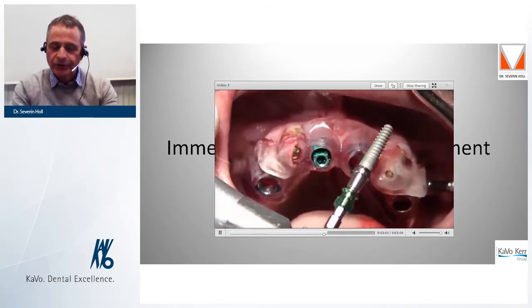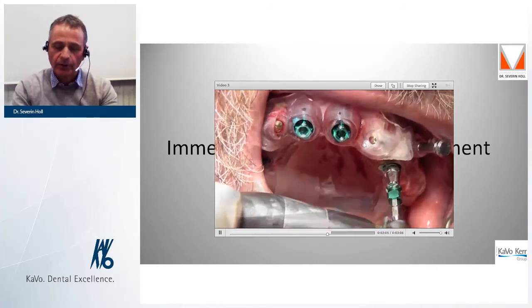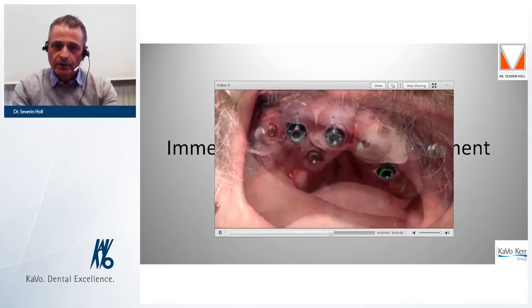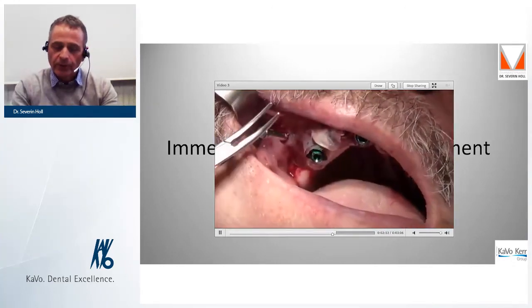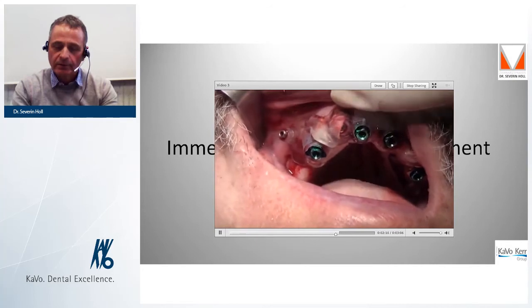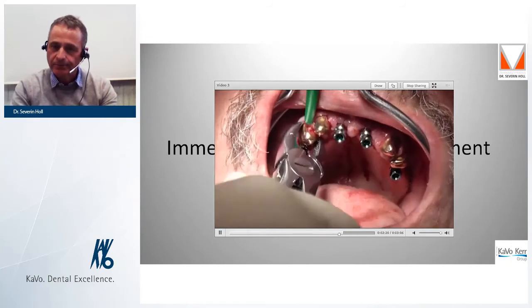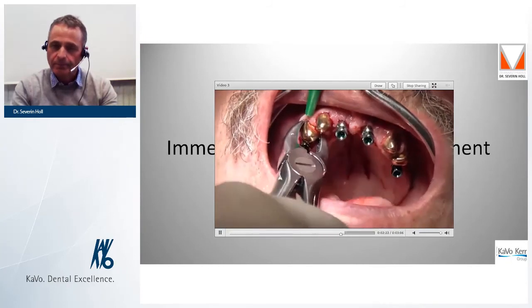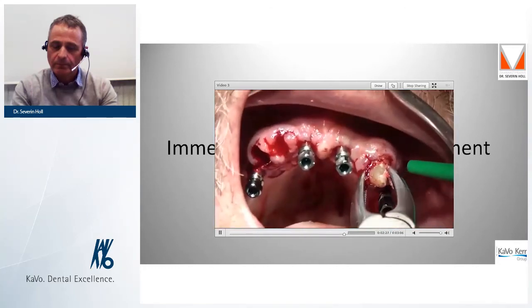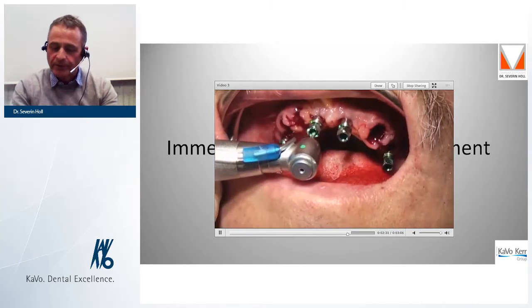Always the same procedure, identical until our last implant, number 4. We remove the surgical template. We extract the teeth. And remove the abutments.